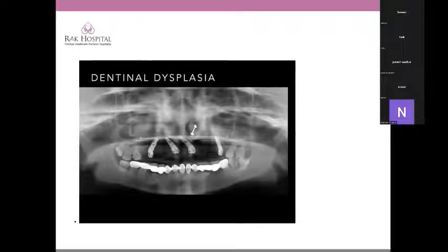So we will see my implants at different angles. This is all planned because the teeth are planned first. So we know where the teeth position will be, and appropriately then we look for, without a lot of extensive surgical procedures, how we can plan our implants. And then you can place the multi-unit abutments and then go ahead and plan your implants. And then we went ahead.